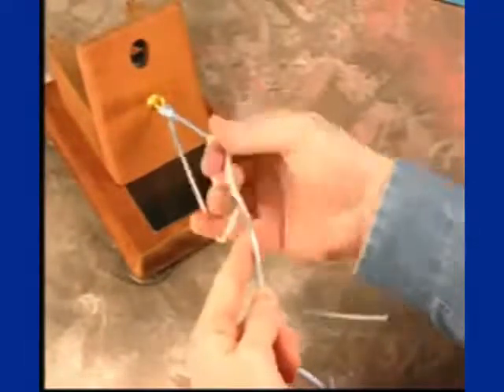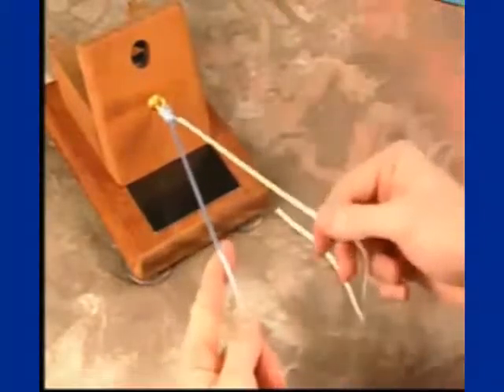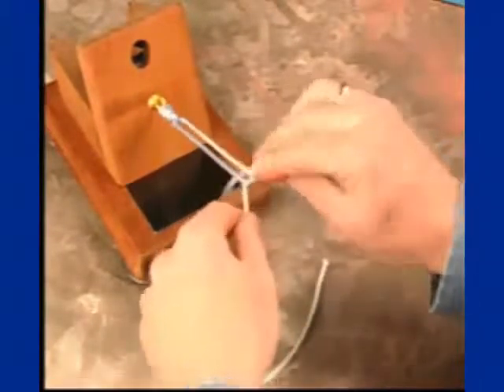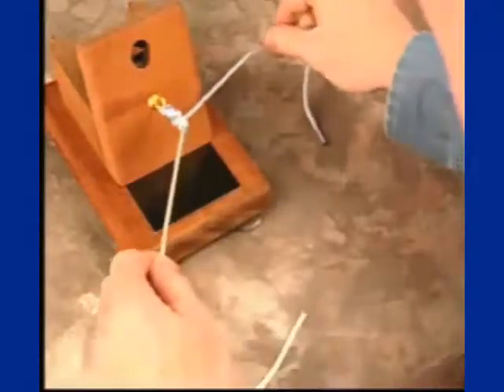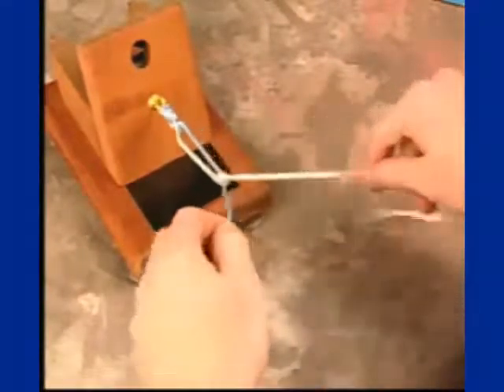Subsequently, while maintaining tension, an underhand throw is placed on your post limb. You then alternate posts, doing an overhand throw on the new post limb, and a final underhand throw, thus securing the knot.